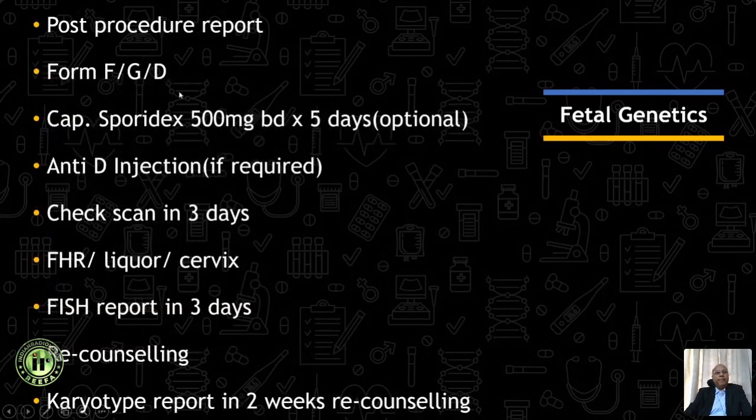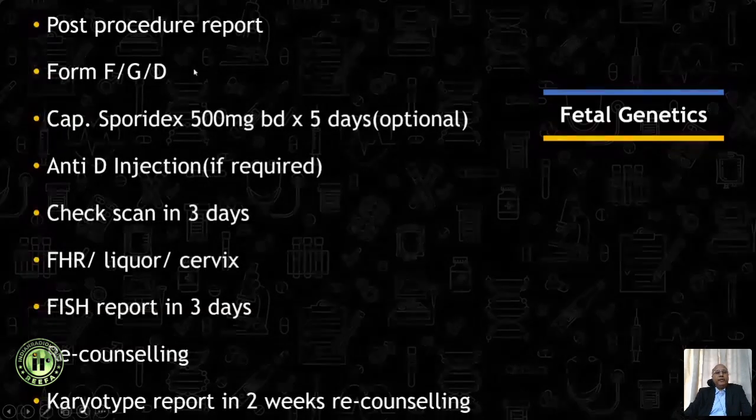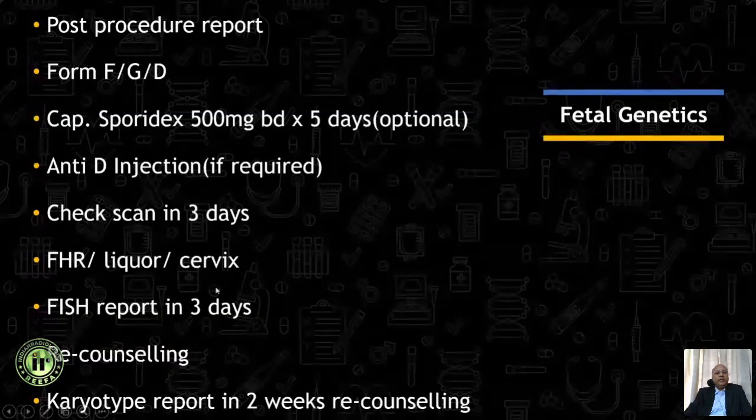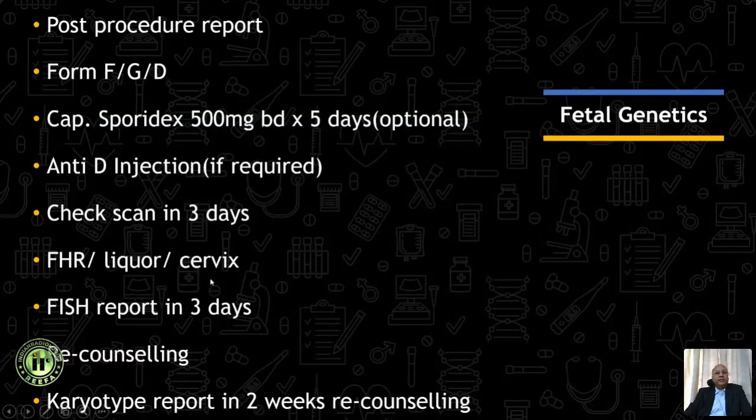Post-procedure report. Form F to be filled, Form G to be filled, Form D to be filled. Antibiotics like Sporidex optional. Anti-D to be given if there is RH incompatibility. After the invasive procedure, check scan in 3 days where we look for FHR, liquor, cervix.